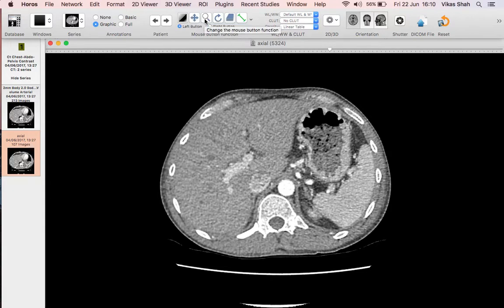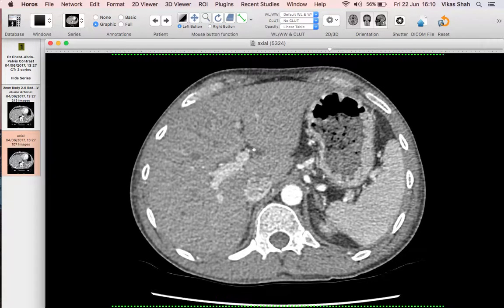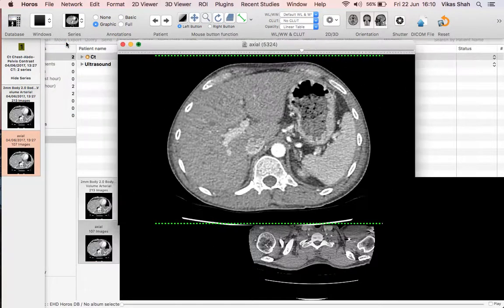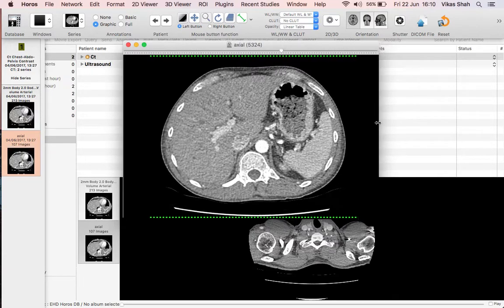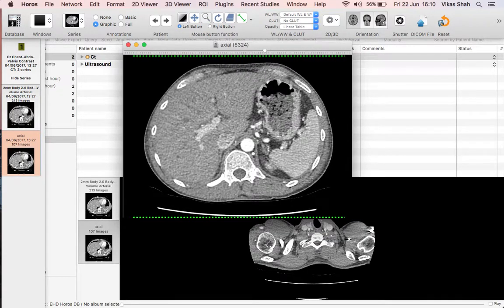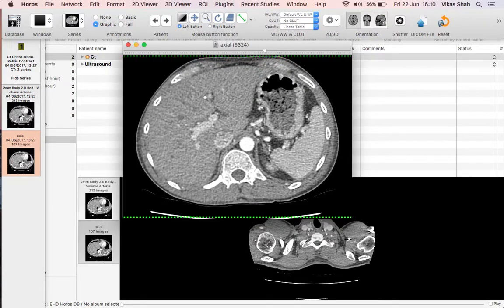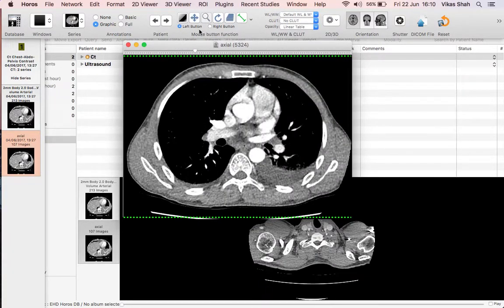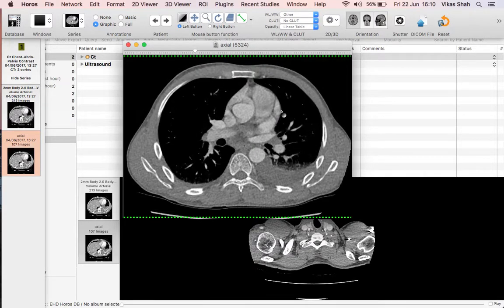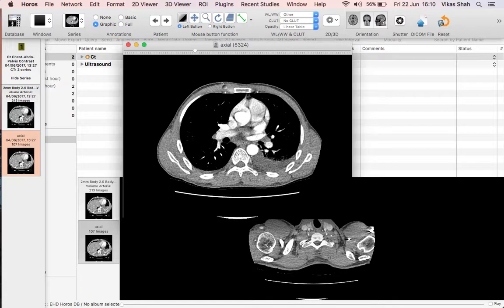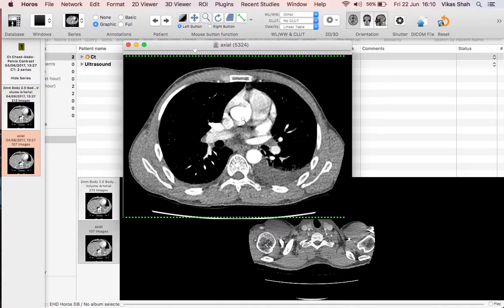To prepare the CT images, you can also zoom them up. Another little trick is you can change the actual frame by bringing the sides in, which makes the image slightly more cropped, and you can export that as well. One important thing to bear in mind: you can't change the window settings in Radiopedia itself, so make sure your windows are optimized for how you want to present the images before you upload them to Radiopedia.